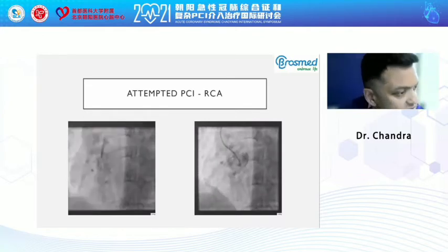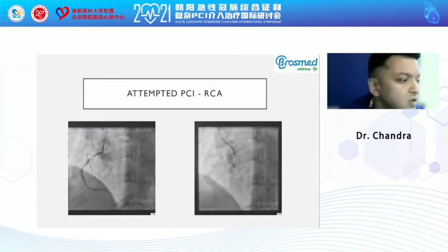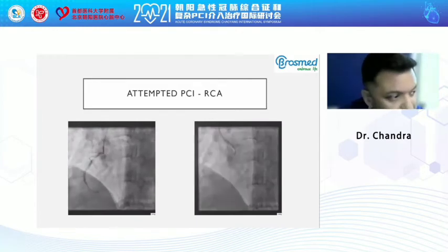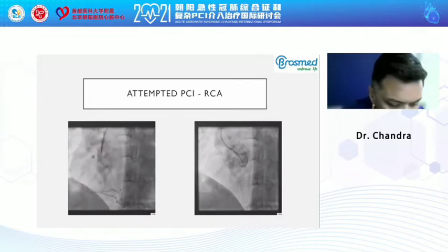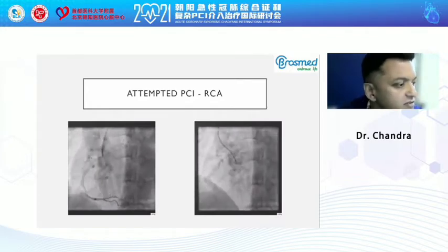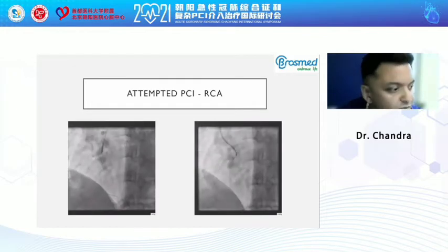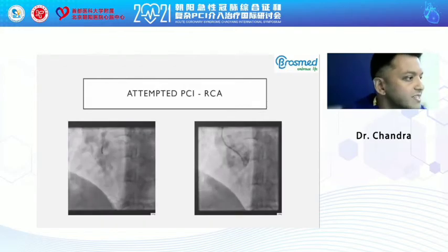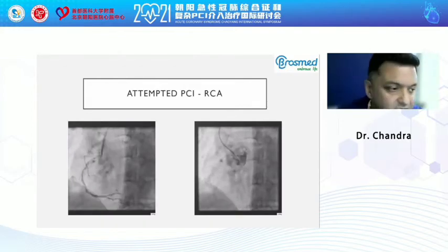We thought we'd get all our extra information, including an echocardiogram to assess the LV function, optimize medical therapy and see how they are from a symptom perspective before thinking about reassessing and readdressing the other coronary lesions, in particular in the right coronary artery. So ultimately, we went on to proceed as a staged procedure to the right coronary artery.